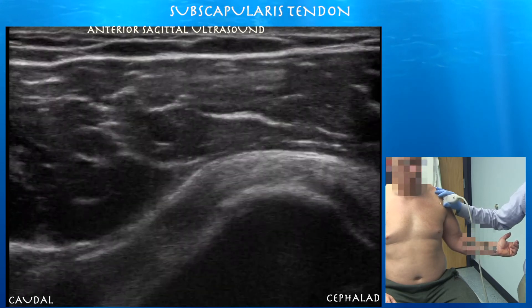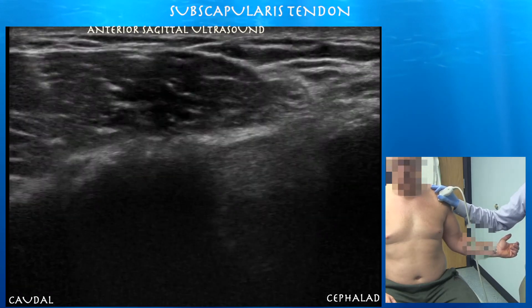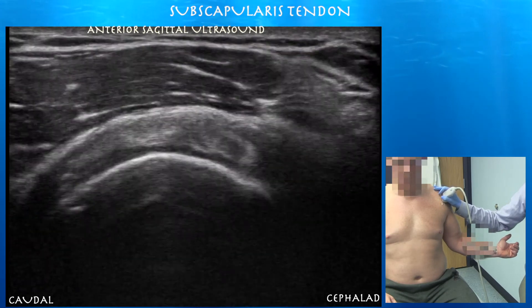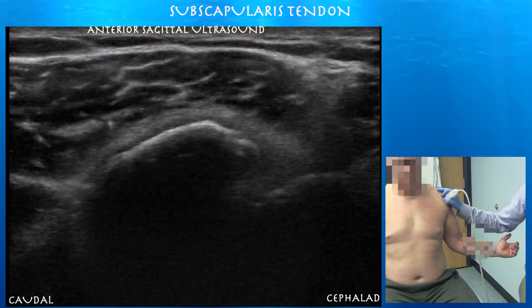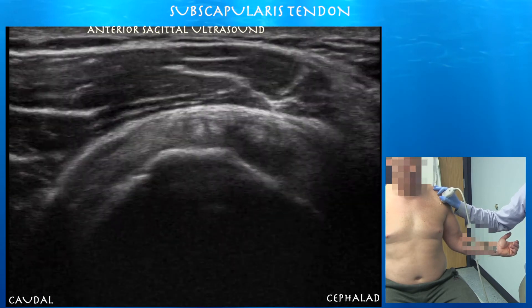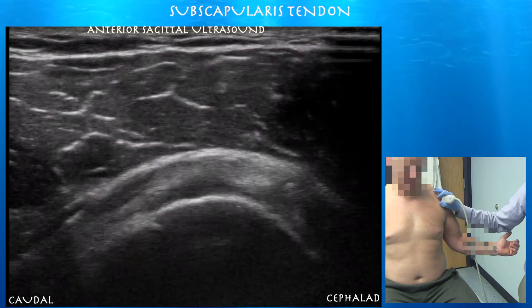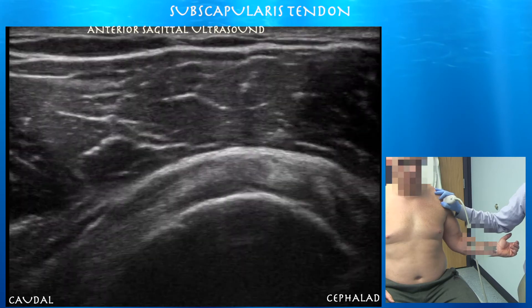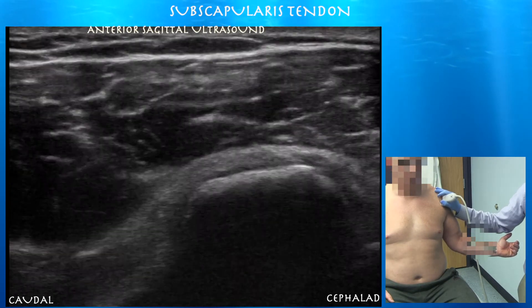The left side of the screen is inferior. You also want to go both in the medial and lateral aspects to cover the whole tendon until it inserts on that lesser tuberosity. We're at image 1813, then 1814, going into the inferior aspect of the subscapularis tendon.